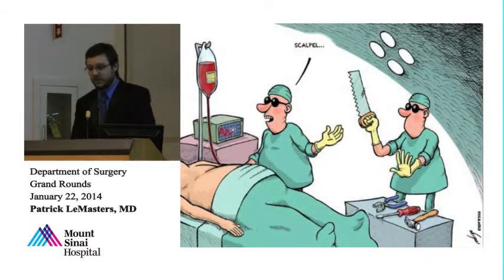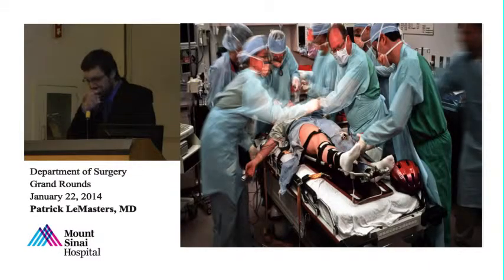Let's talk about another study that we've adopted as surgeons and we can discuss today. And this is in trauma. So ultrasound was first used in the evaluation of trauma in Europe. They're always ahead of us in everything, basically. This started in the 1970s.